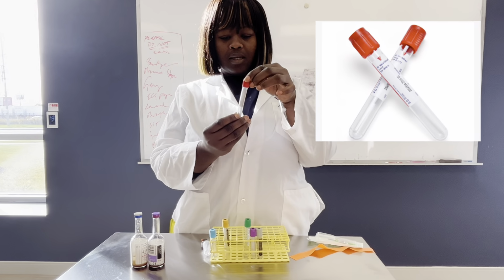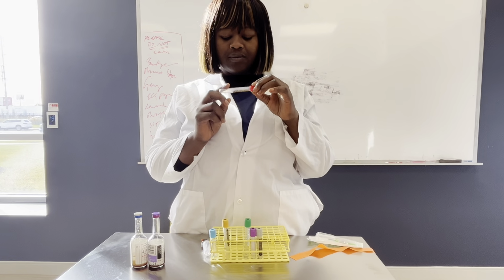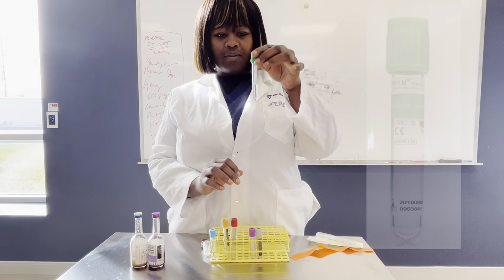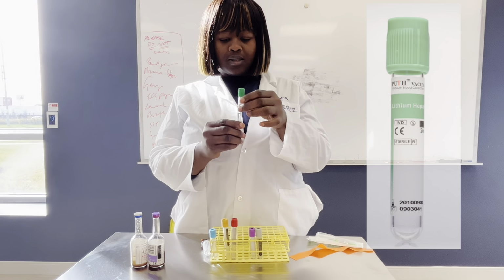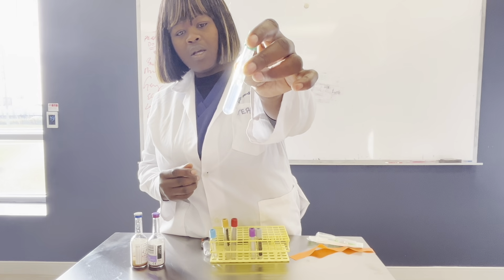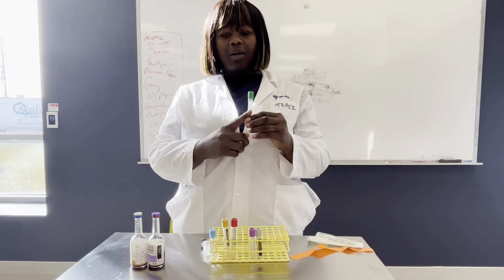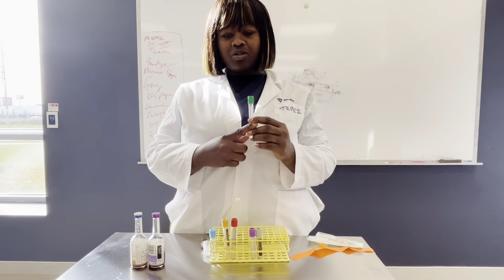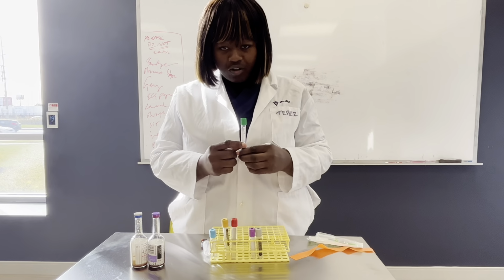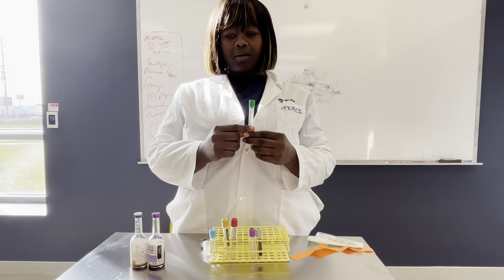So next, in the order of draw, are the red tubes. These tubes contain no additives. Then we have the heparin, the green top tubes. These include heparin. You can see? Heparin is an anticoagulant and is commonly used for plasma determinations in chemistry tests, such as electrolytes, some enzyme assays, and various other chemistry panels.